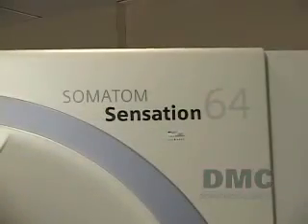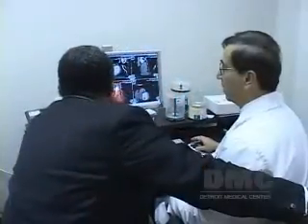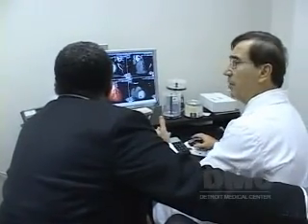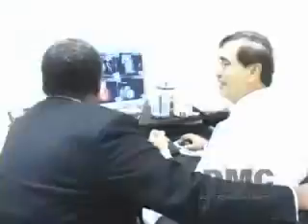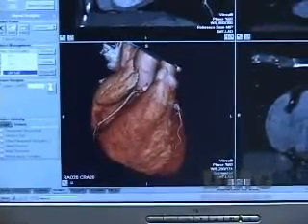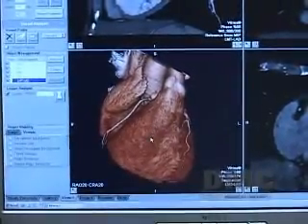So, John Lohr's colleagues at the DMC suggested he undergo the CT64 slice imaging test that yields a 3D look at the heart. His doctor, Pierre Atallah, who is director of coronary angiography at Harper University Hospital, explained the advantages of this non-invasive approach. Take the shots at different moments where the heart is at rest, and then image the pictures and get quality that's very superior to be able to analyze it and diagnose disease without having to do cardiac catheterization, which is the traditional way we did these things, by going to the heart, putting catheters in there, and accessing the heart by invasion. There is no invasion here.